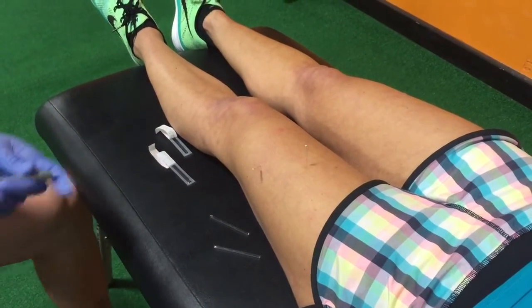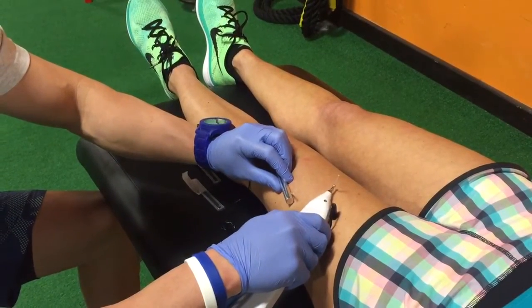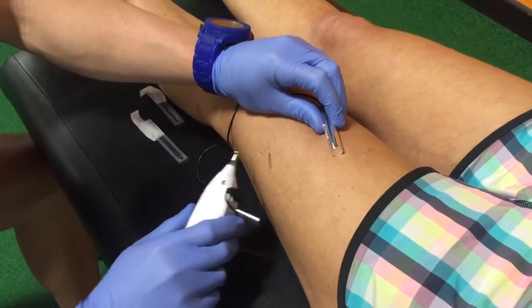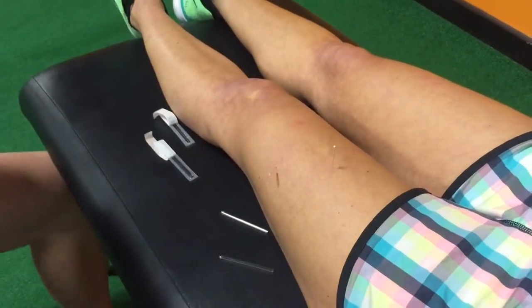Next step — take the e-stim unit and we're going to get a little bit of a muscle twitch out of it. You can see the vastus lateralis twitch response, and we're going to switch these two up. You're going to see the muscles going again. Quick and easy.